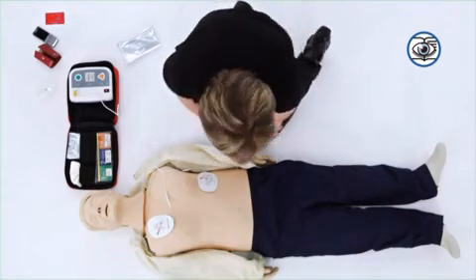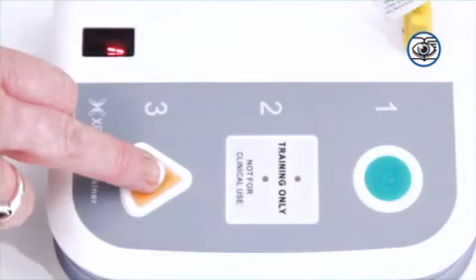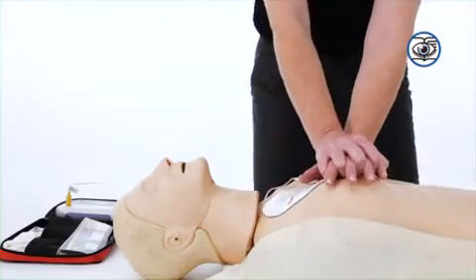Charging. Stay clear of the patient. Press the shock button as directed by the voice prompt of the AED. Deliver shock now. Shock delivered. If the AED prompts you to start CPR, start chest compressions immediately. Start CPR.